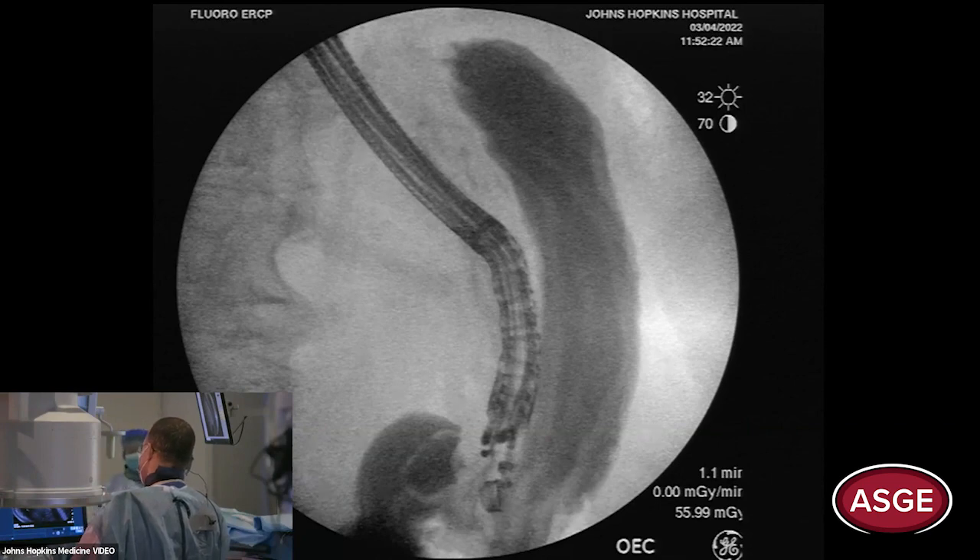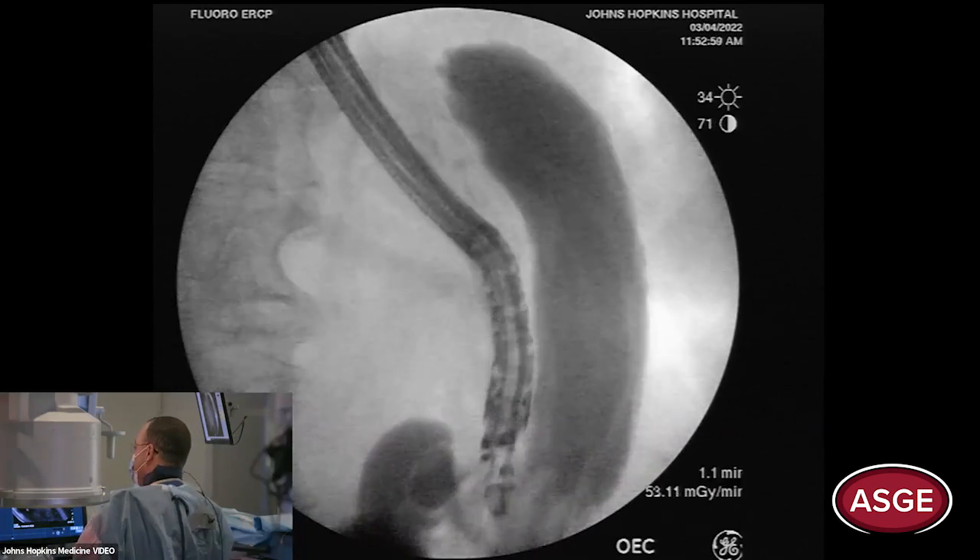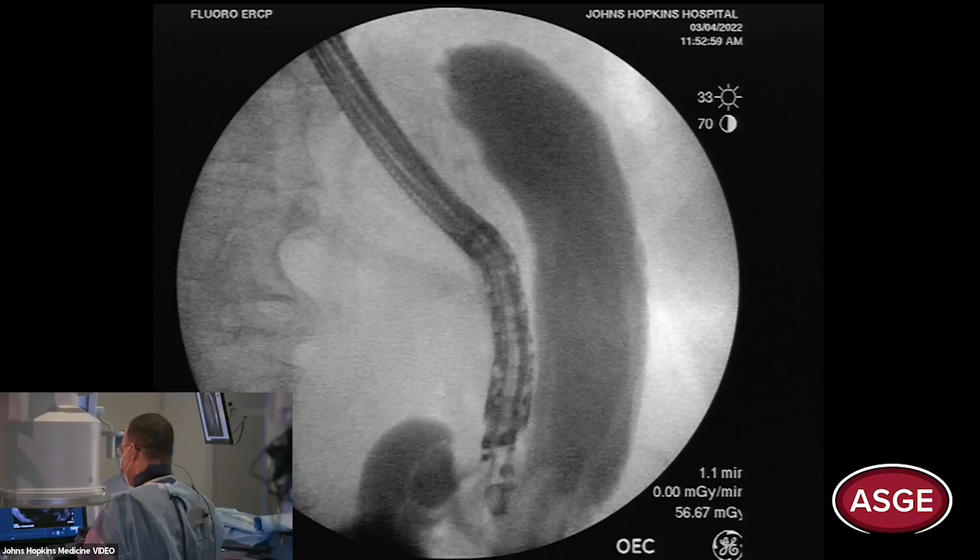Initially we had a little intramural injection — you can still see it there. This is why the test injection is important: you don't want to put the pump right away. Do the test injection, make sure the contrast is pooling back into the fundus, and you know it's in the lumen. That's key.